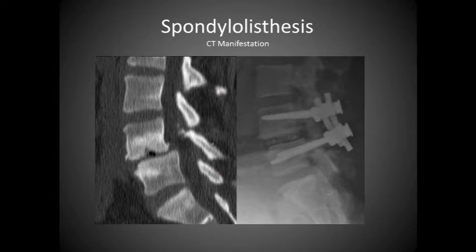Here's a minor spondylolisthesis. We see some slight anterior slippage, probably around 5 to 15%, but we do see that it does create some impairment of the spinal cord, and because of this, we have surgical remediation, which will correct this and hold them in place.